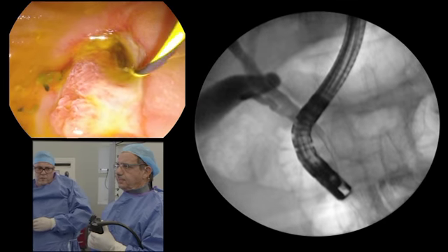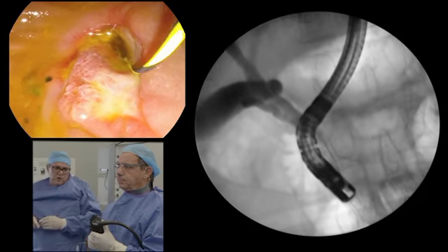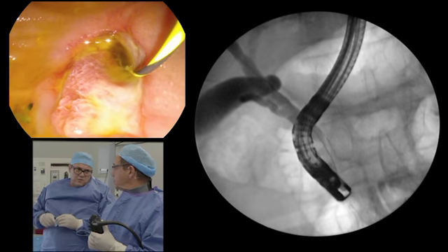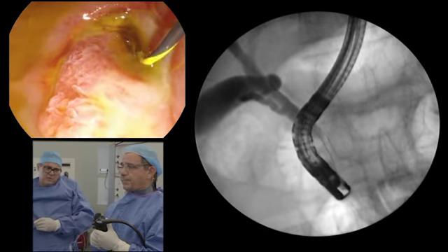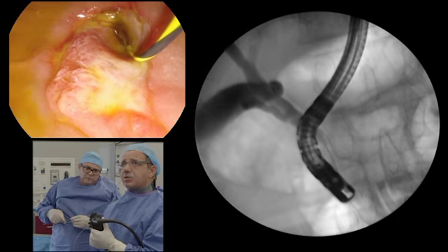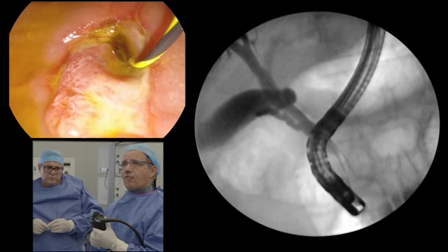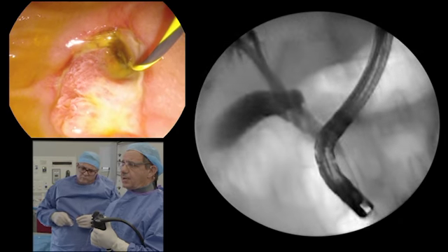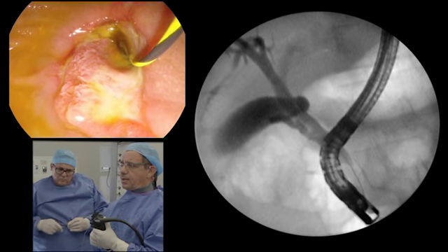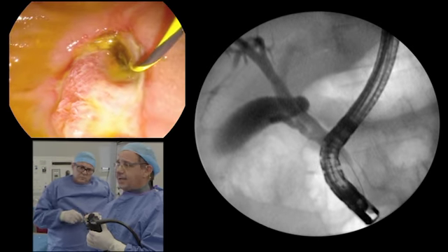Okay. What do you need to give you now? Do you want the cytobrush? Cytobrush and biopsy, both. Yes. You need the combination of both, which is more accurate than the use of only one technique.